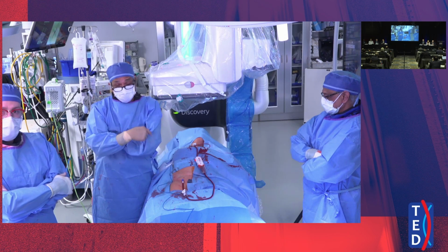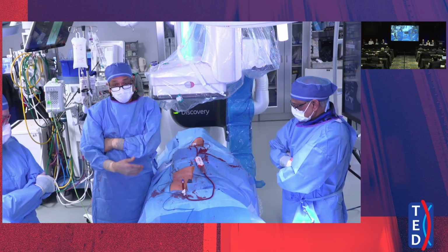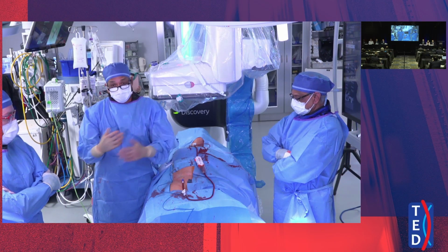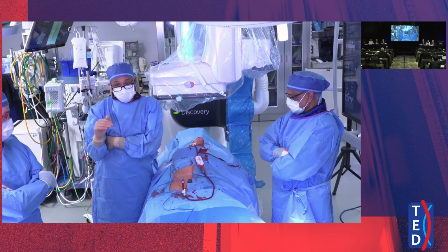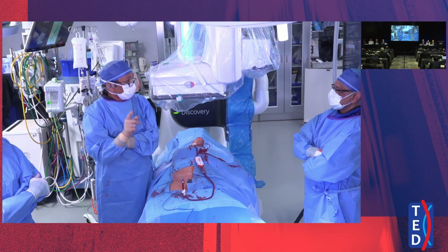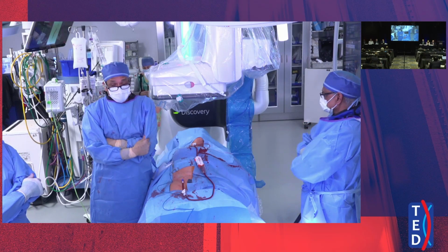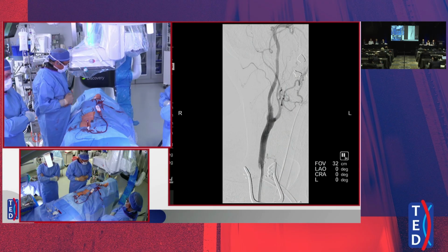And if and when Performance 3 is approved, it means you have reversal of flow, and then you go ahead and put a filter, balloon, and stent at the same time via the transcarotid option. So this is where the argument is: have we reached the optimum level of comfort in the regular TCARs that we are doing? So with that, you all discuss, I will listen, and let me get this off so that the patient can leave the room and we can start the next case. So thank you so much for your attention. Thank you.